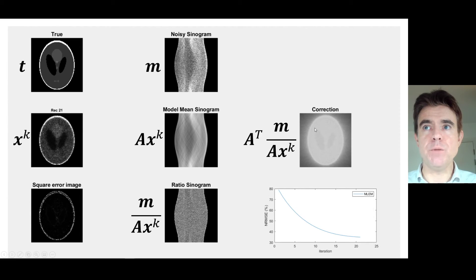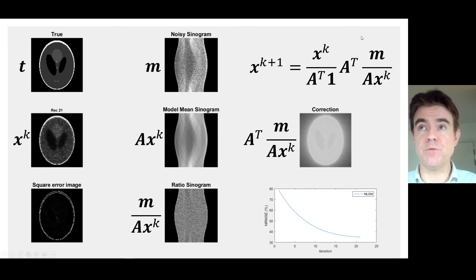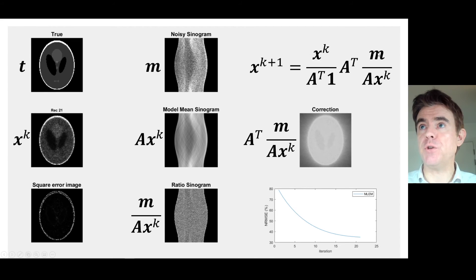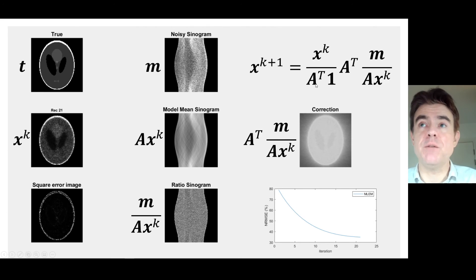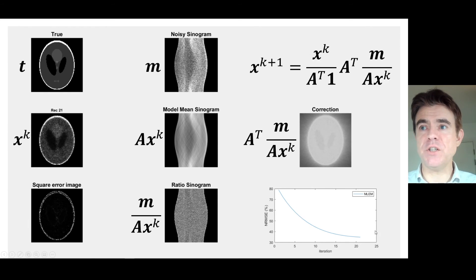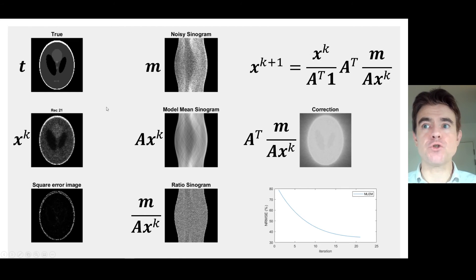And then finally we multiply — but first we divide by the sensitivity image — to get the next update. So that's the complete algorithm, which I've just coded up live in this video. We're doing Radon to forward project, doing the ratio, back projecting using A-transpose, multiplying by the current reconstruction to get the next update, and dividing by a back projection of unit data — just a sinogram filled with ones. I've also calculated a squared error image comparing the reconstruction to the true, and I'm plotting a normalized root mean square error as a function of iteration to track progress.